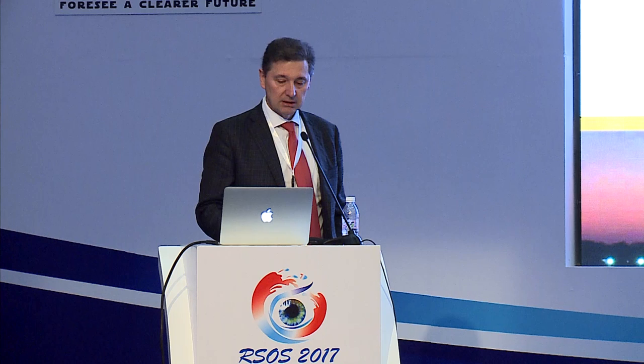The conclusion of this poster was that between LASIK and advanced surface ablation for high myopia, there wasn't a very big difference. Stability was slightly better with LASIK. Both procedures gave more gained lines than lost lines. Both are very safe: 0.5% lost more than two lines. I'll remind you that for the FDA, a procedure is unsafe when more than 5% lose more than two lines. It's a very, very safe procedure. You see the number of patients losing a line, and more than 30% gain lines in each group. This was doing wavefront optimized treatments. Subsequent to this, we did the ray tracing study, and with ray tracing, the accuracy in high myopia was 90%. So I don't agree with the group who say LASIK over minus 8 has no place. I think it has a place frequently.